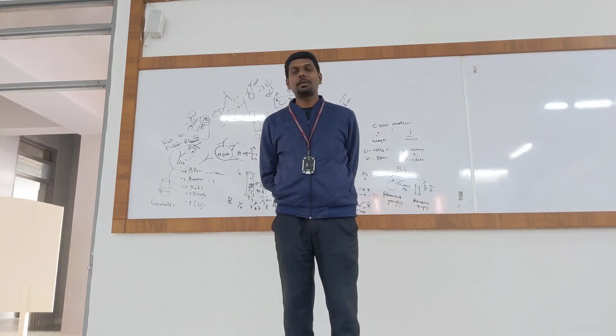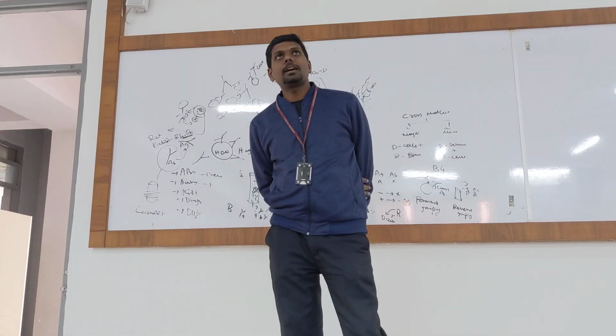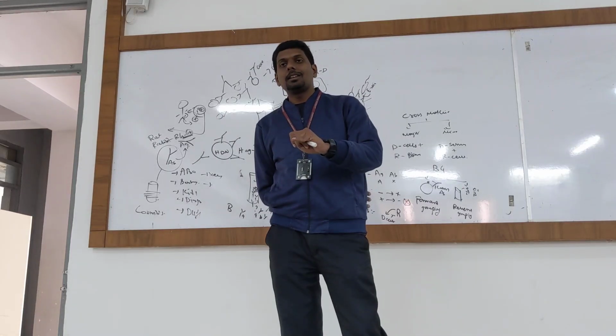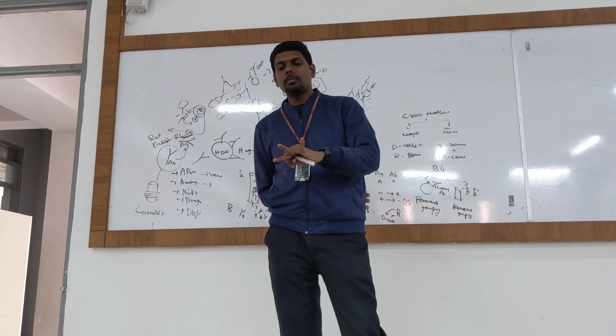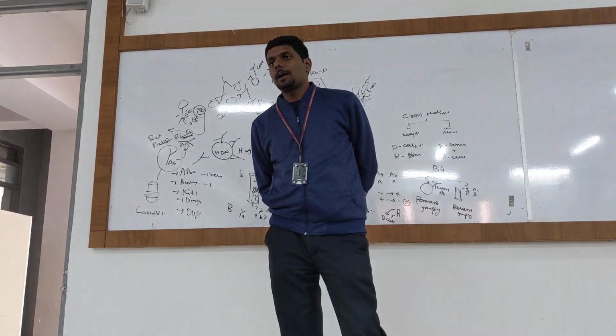So if a patient gets a Coombs positive, there might be hemolytic disease of the newborn, erythroblastosis, or a Bombay group condition.